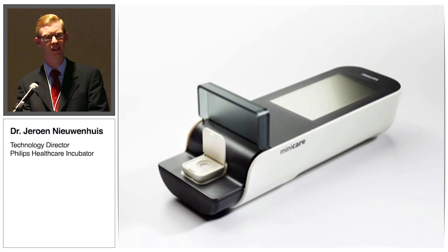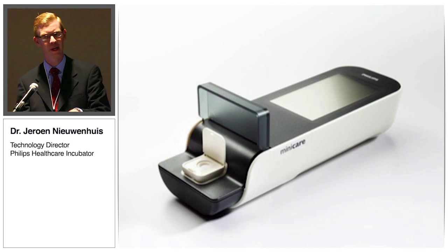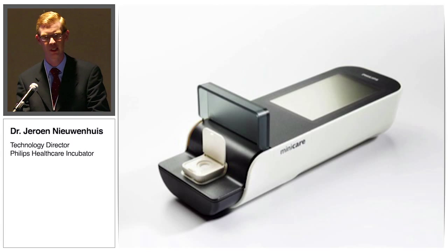So we have electromagnets, and with these electromagnets, the protocols by which we switch them on and off, we can control very precisely the timing of the assay. So the incubation time, the exposure time to the binding spots on the surface, but also the stringency force with which we separate the bound and the unbound particles.